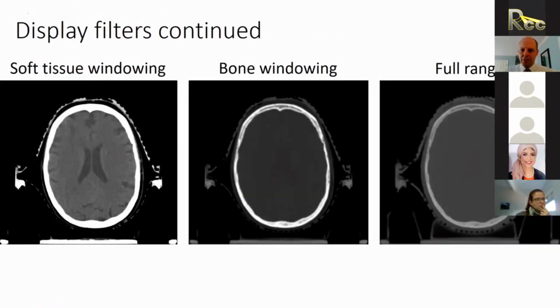And the same thing with the 3D images. So this is a CT image, and you can see there's three different windowings here. One is the soft tissue windowing. You can see the soft tissue within the brain very well here for a CT. Another would be the bone, but as you can notice on this left one, the bone is kind of saturated out. So it's actually hard to tell where the bone really starts and ends.